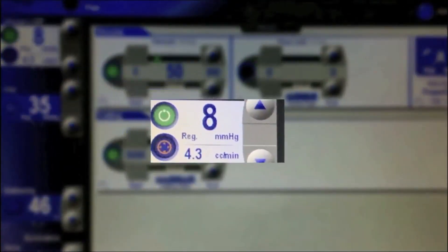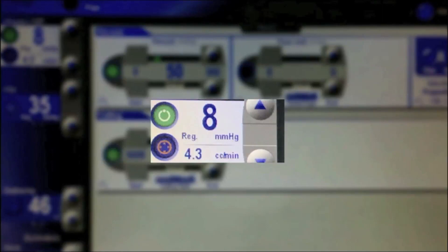The first step is to perform a low IOP vitrectomy. This offers the same advantage as paracentesis and other IOP-lowering methods would offer. It reduces the resistance offered by the intraocular pressure to the ocular perfusion from the central retinal artery. Also, the prolonged low IOP facilitates the movement of the embolus in the central retinal artery towards the retina.